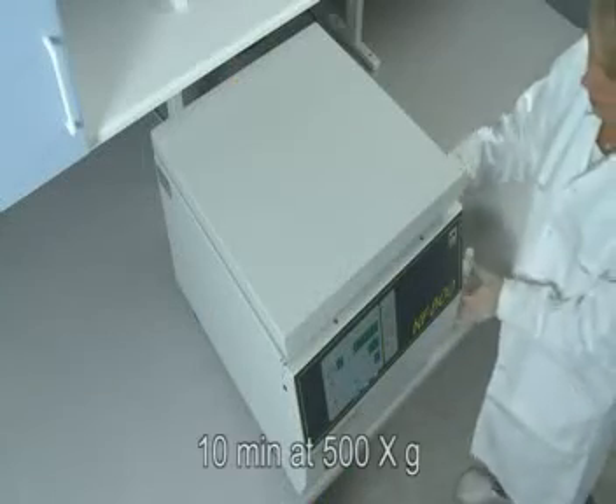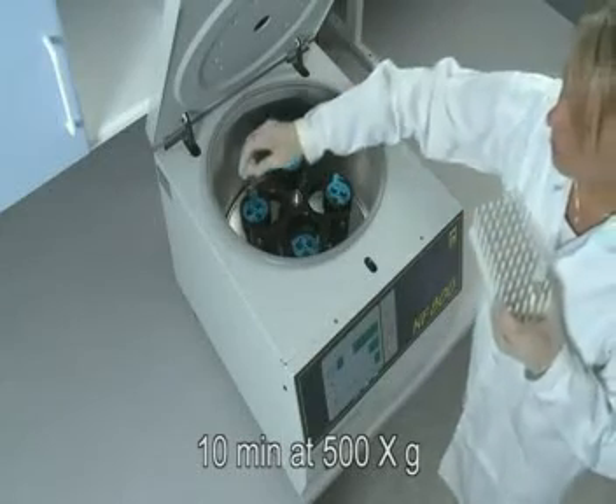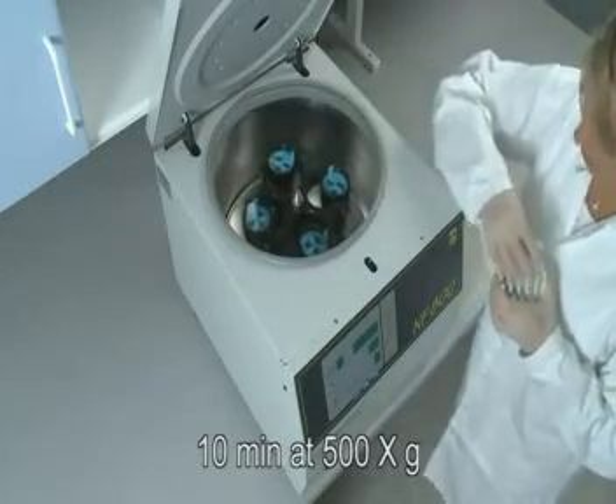Centrifuge for 10 minutes at 500 times G. Calculate the correct RPM for 500G for your centrifuge.